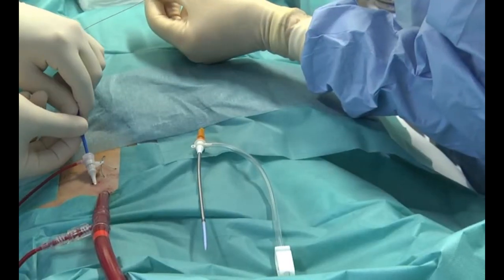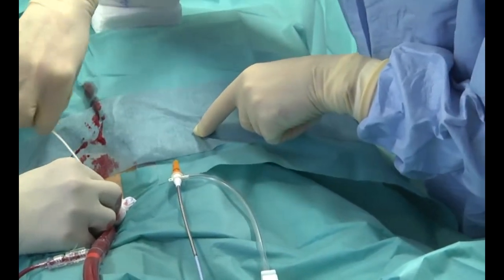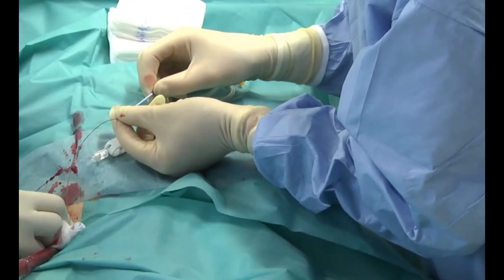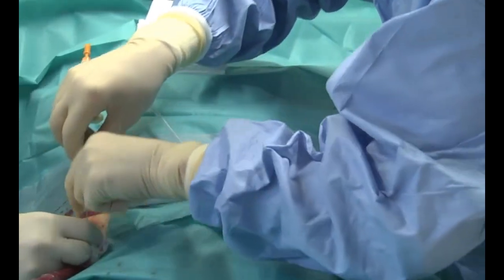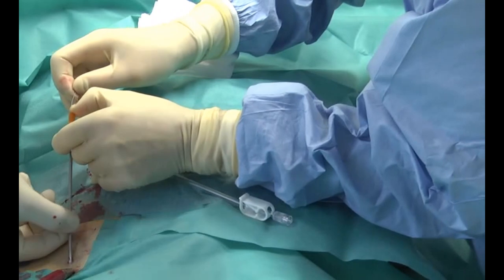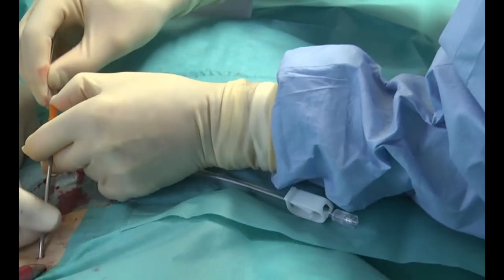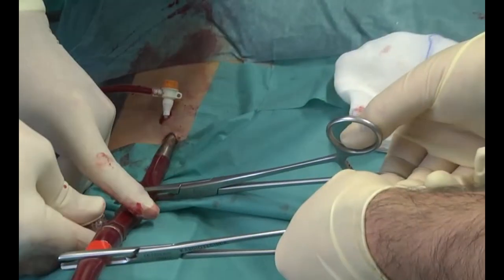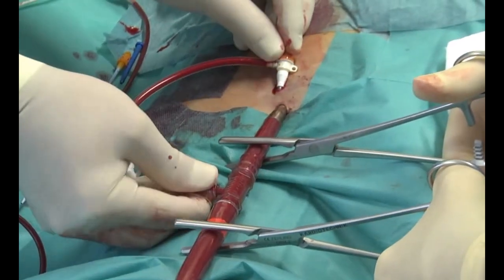What is the purpose of the reperfusion cannula? The reperfusion cannula provides blood supply to the lower limb, which is obstructed by the arterial cannula in the femoral artery. We take blood from the connector of the arterial cannula and deliver it through a Y-connection into the superficial femoral artery, which then supplies the lower limb. Here we can see after insertion of the new reperfusion cannula, how there is improvement in lower limb color and improvement in oxygen saturation after opening of the clamp.